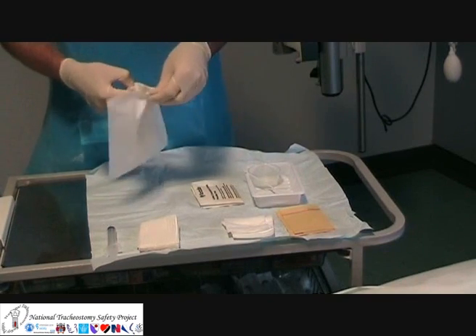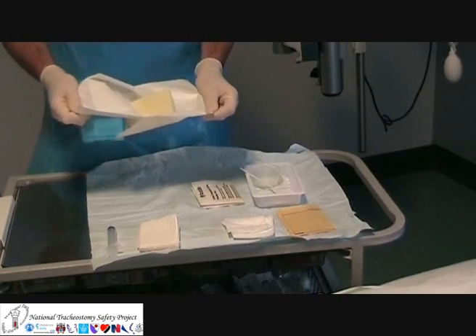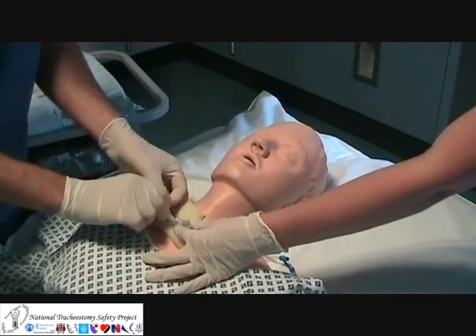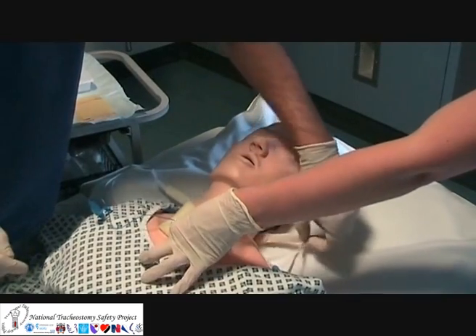A tracheostomy stoma must be kept clean and dry. Single-use absorbent dressings can be used between the tracheostomy tube and the stoma itself. These should be changed regularly.